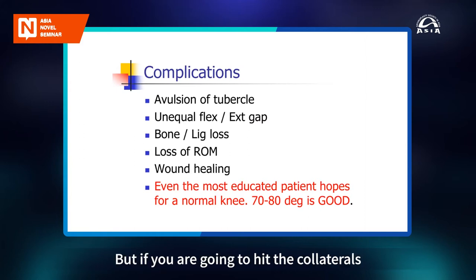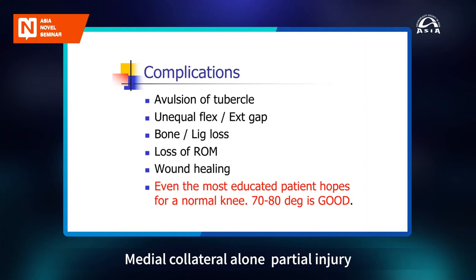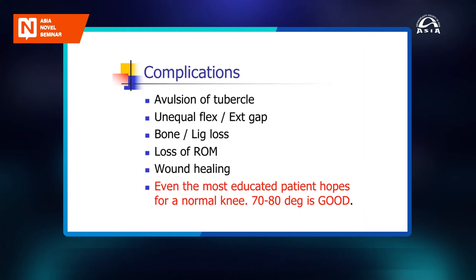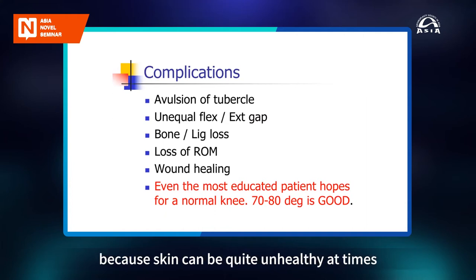But if you're going to hit the collaterals, then you have to be careful which implant to use. Medial collateral alone, partial injury, you can use varus valgus constraint. But if both sides are badly damaged or you're not able to retrieve, then again, you're going towards hinged. Then in these cases, loss of range of movement is known and the wound healing can be a problem because skin can be quite unhealthy at times.